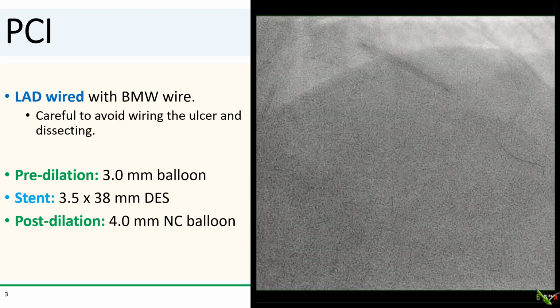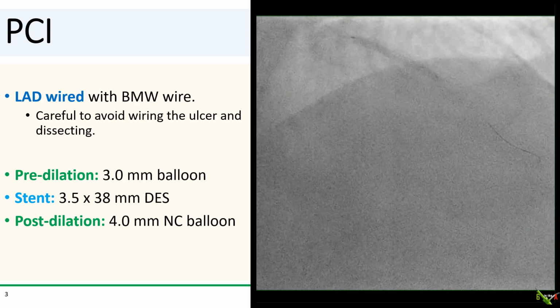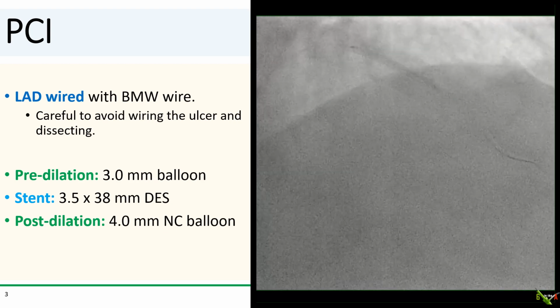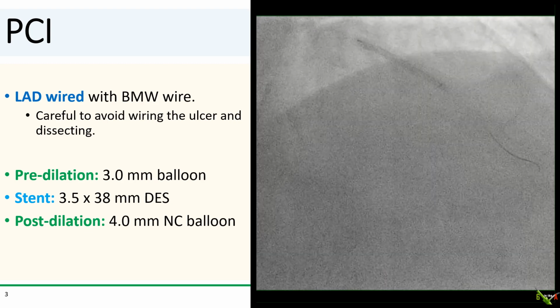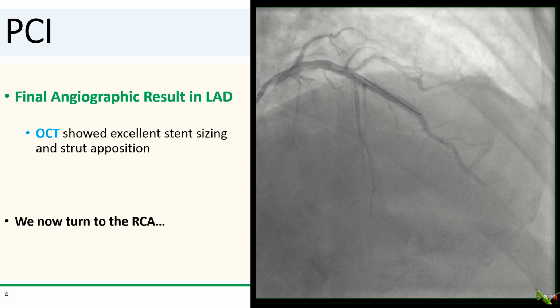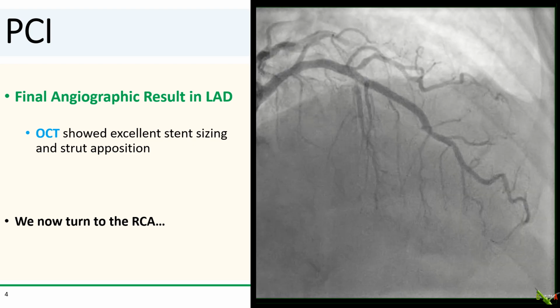So we wired the LAD very carefully with a BMW wire, being especially careful to avoid wiring the ulcer and dissecting the vessel. And once the wire crossed, things were relatively straightforward. We used a 3.0 predil balloon, a 3.5 stent, and a 4.0 postdil NC balloon. And we had a very nice final angiographic result in the LAD.